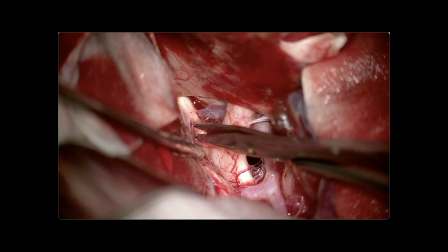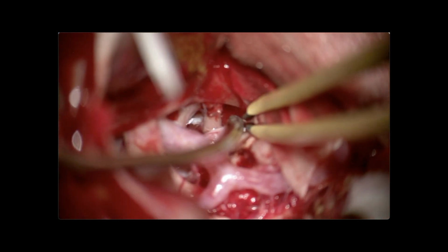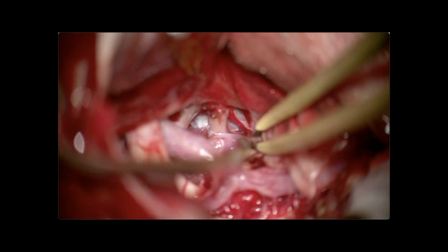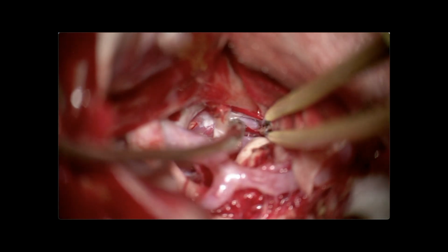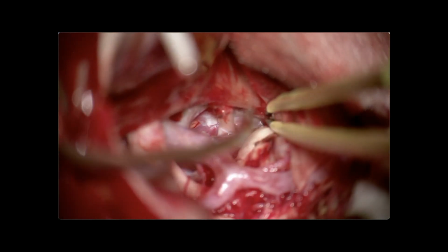I am opening the arachnoid cisterns over the chiasm. Next, to expose the retrocarotid space, we dissect the Liliequist membrane. The third nerve is also visualized. Partial subpial resection of the uncus of the temporal lobe is performed. The edge of the tentorium is visualized.